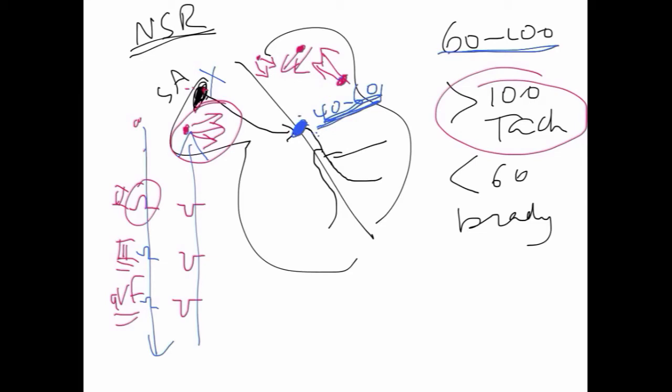Why? Because the heart rate is going to, there's electricity going to go up and down at the same time. So you're going to have a QRS, and inside the QRS, there's a P wave that's going like this. So you won't see the P wave most of the time. And this is called junctional. And that's as if it's coming from the AV node.